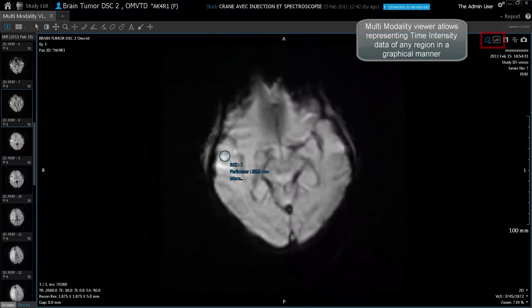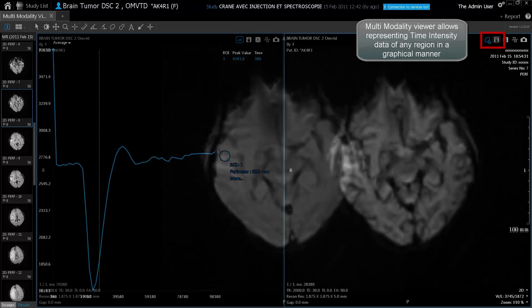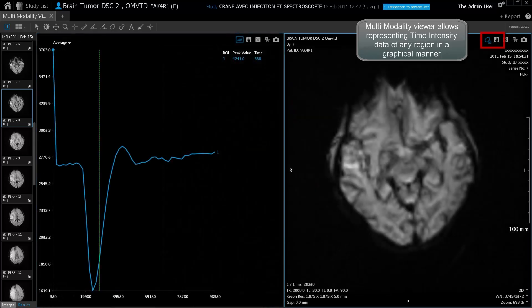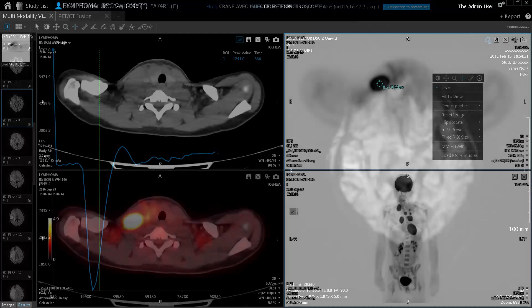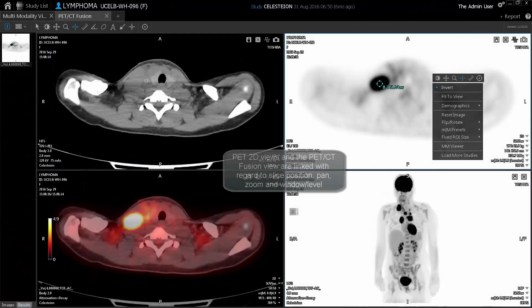Multi-modality Viewer allows representing time intensity data of any region in a graphical manner. PET 2D Views and the PET CT Fusion View are linked with regard to slice position, pan, zoom and window level.